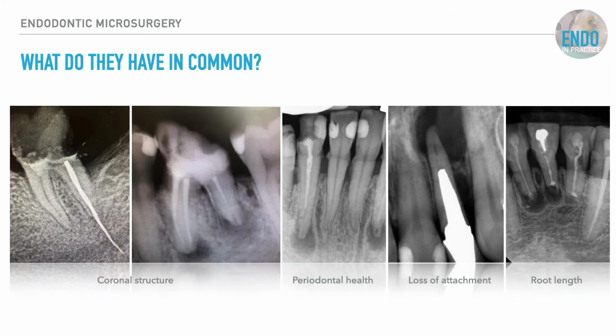The other thing, it's a little pet hate of mine, but when I see that amount of calculus on a radiograph, that's a reasonable amount of calculus. If I'm going to go and do surgery on someone, at least in the area that I'm going to do surgery, their oral hygiene has to be meticulous. It just makes your surgery a lot more complicated with the management of the tissue.